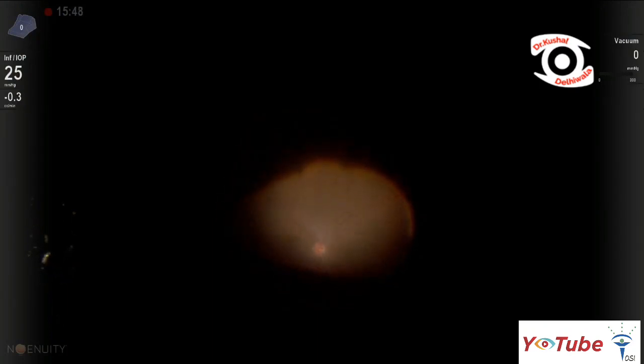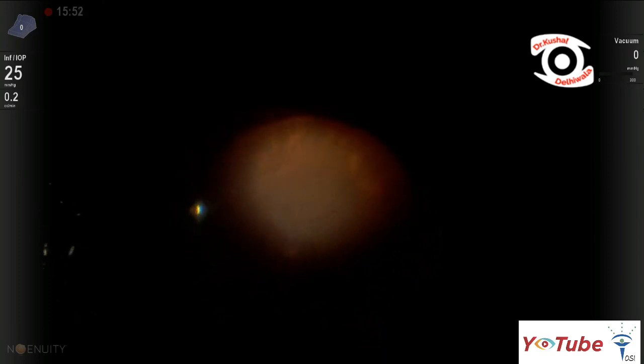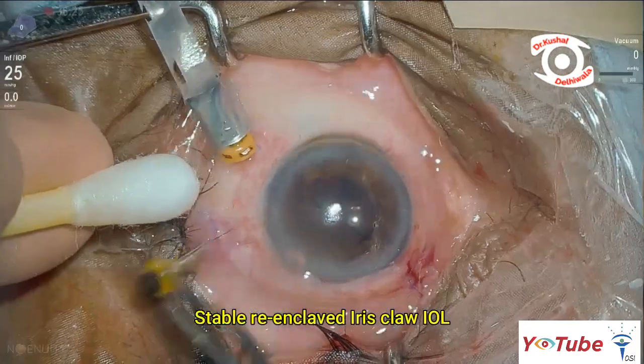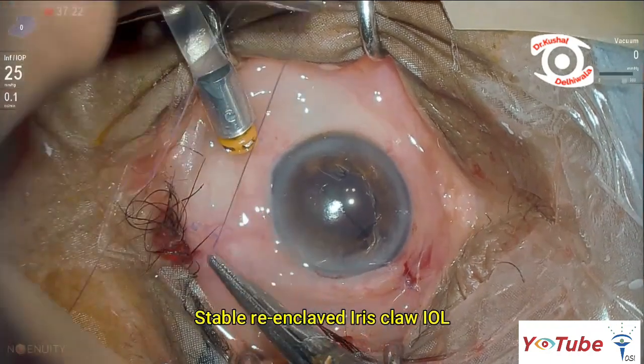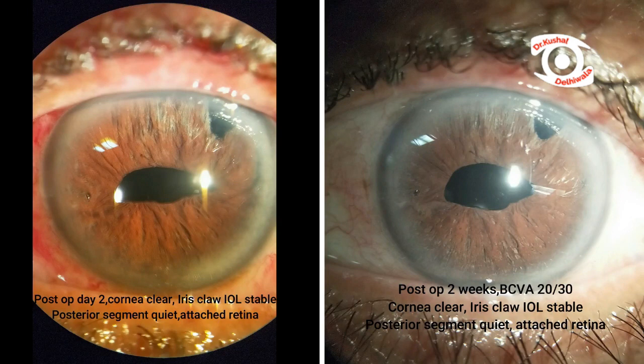The fundus was re-assessed using the light pipe and was found to be normal. The case was closed with a stable IOL. Post-operative evaluation at 2 weeks showed BCVA maintained at 20/30 through the iris claw lens, a quiet anterior segment, horizontal ovalization of the pupil, and attached retina.